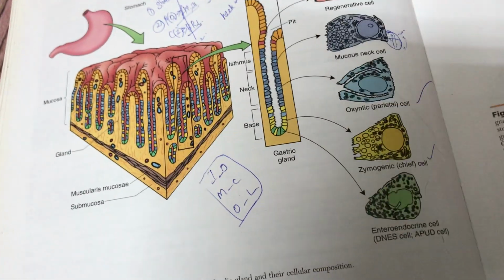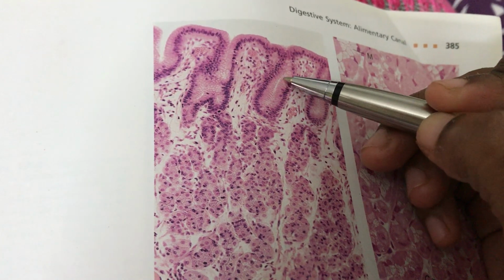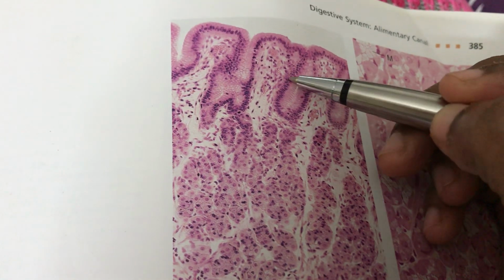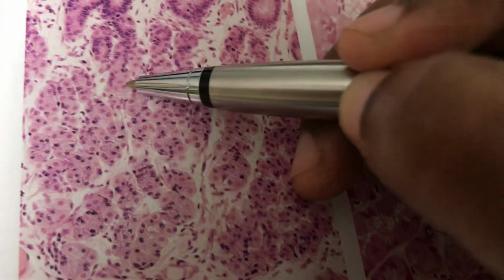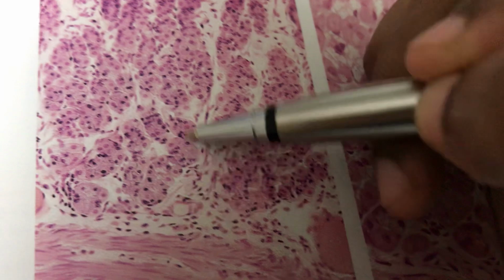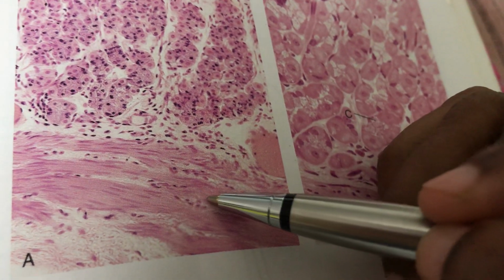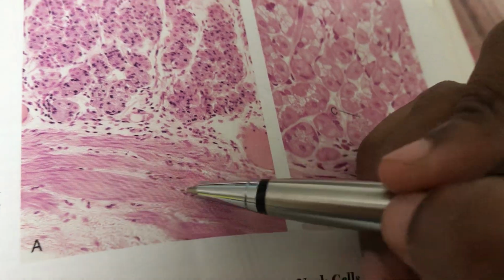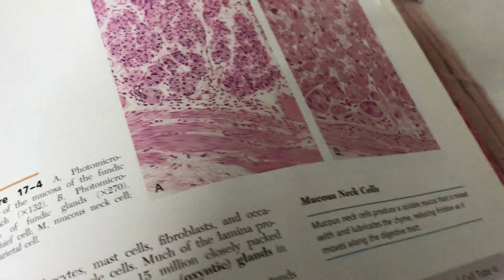And the next one is here, if you see, can you see the fundus, gastric pits, very shallow gastric pit. You can see the simple columnar epithelium. You can see the lamina propria. Lamina propria contains glands. And then next is submucosa, and then muscularis externa. Here you can see the muscles. That's all about the stomach fundus.